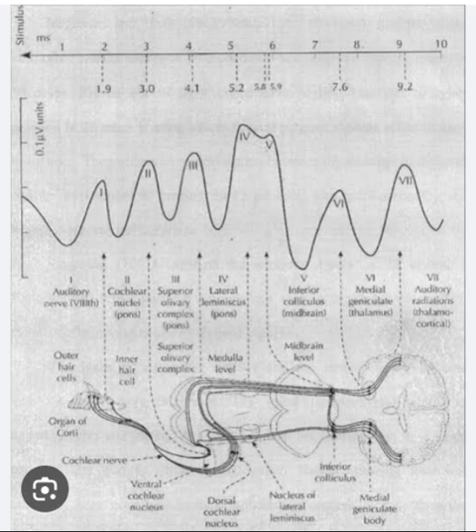2. Tone bursts. Narrowband stimuli with a specific frequency and duration. They are often used in BERA testing to assess frequency-specific information and to evaluate specific components of the auditory pathway. Tone burst stimuli can produce waveforms with distinct peaks similar to click stimuli. However, the morphology of the waveform may vary depending on the specific frequency and intensity of the tone burst used. The latency values of tone burst evoked waves may differ from those evoked by clicks due to the specific frequency of the tone burst. And 3.